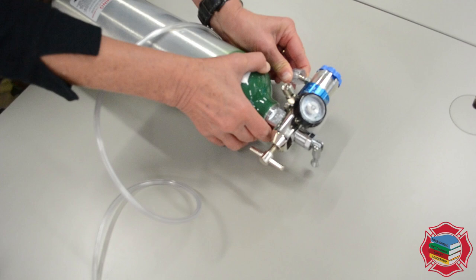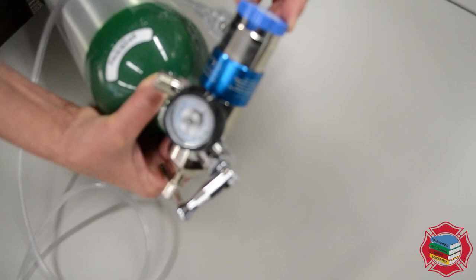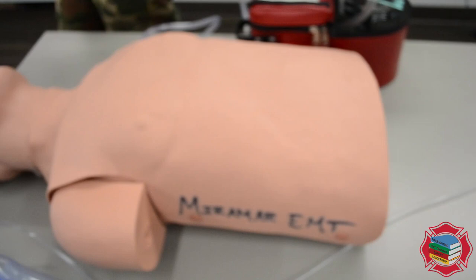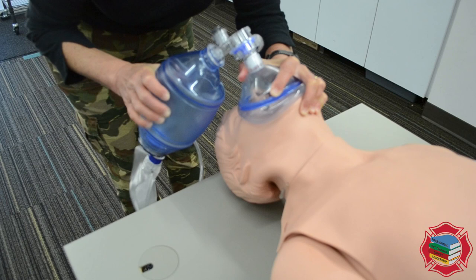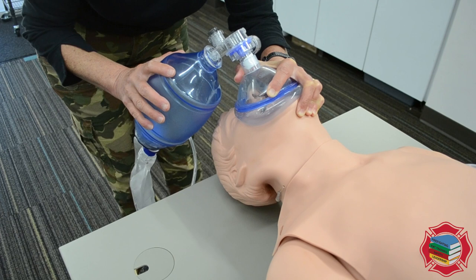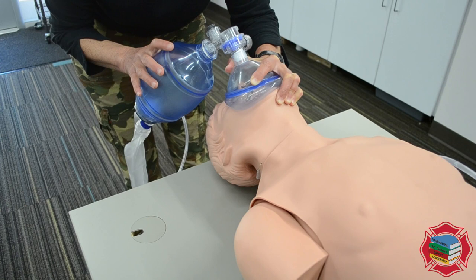Now I'm going to hook this BVM up to oxygen. We'll turn it on and dial our flow rate to 15 liters per minute. We'll go back up to the patient, reopen the airway, and ventilate: 1-1000, 2-1000, 3-1000, 4-1000, 5-1000 — ventilate. We're delivering adequate volume with each ventilation. I know that because I'm seeing appropriate chest rise.